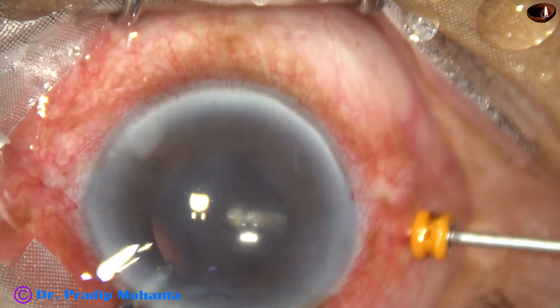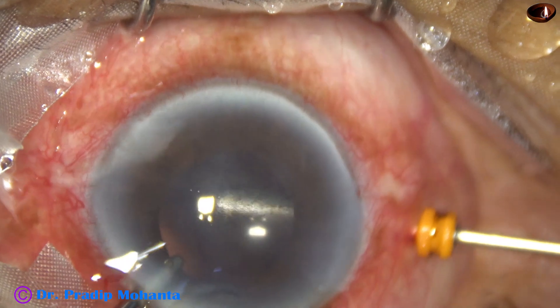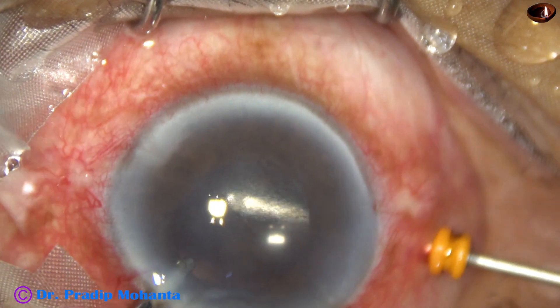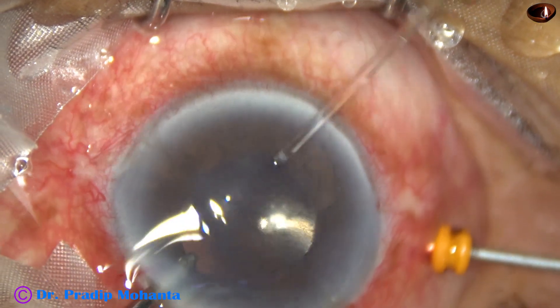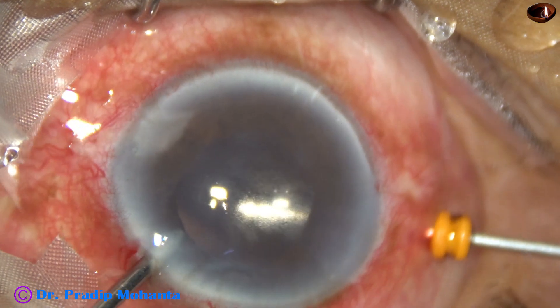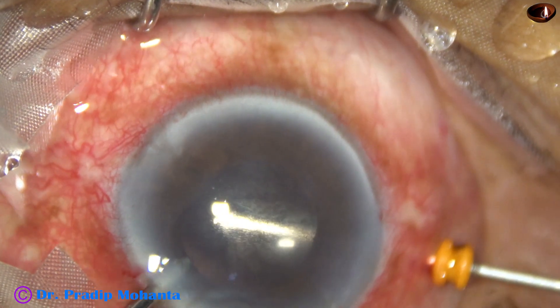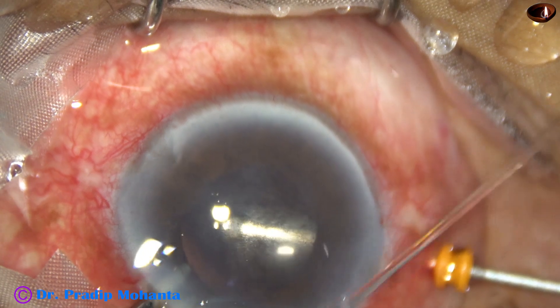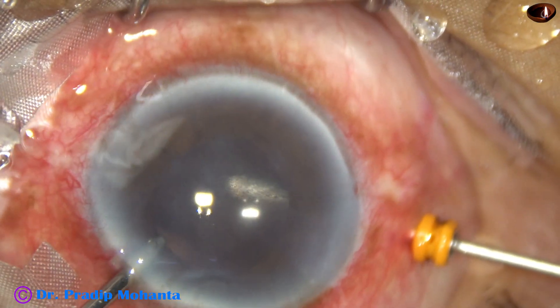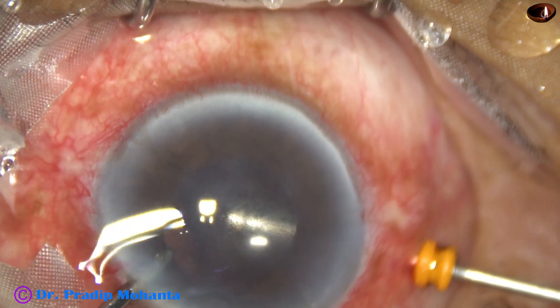At this moment I am doing anterior vitrectomy. I have placed a trocar at around 10 o'clock, about 3 mm away from the limbus. Irrigation is from the limbus and the cutter is being used through the pars plana route.